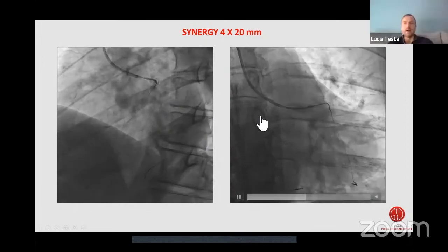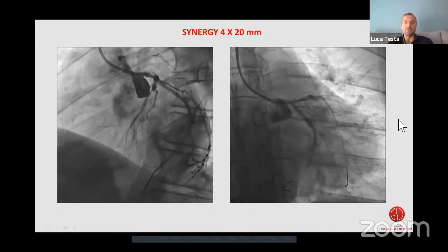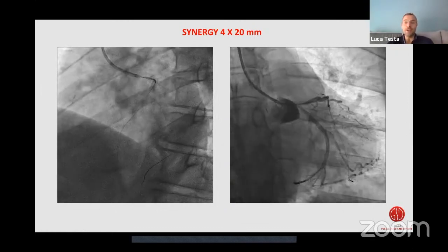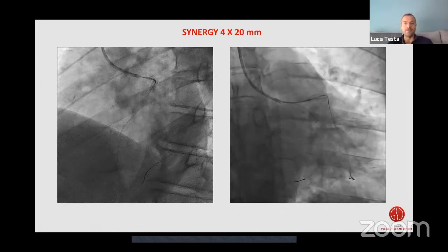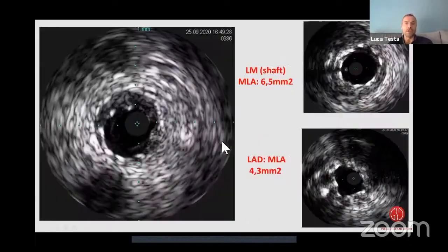Okay, good. So look, the fellow very close to me said, look, let's do the IVUS. Yes, sure. With the dissection left, let's do the IVUS. Yeah, it was a very, very nice call. Anyway, I said, look, let me put the stent and then we'll discuss for the rest of the afternoon and then we'll do the IVUS every time you want. Anyway, so patient was going down. So I said, look, I will put a stent, I will secure the situation and I'll post-dilate, I'll do the kissing balloon, minus side, and then we will check.